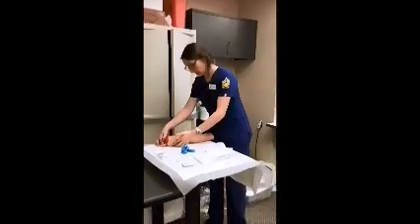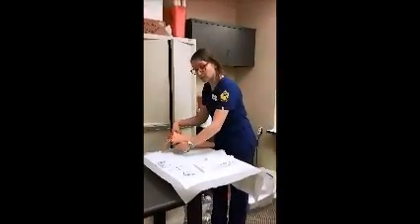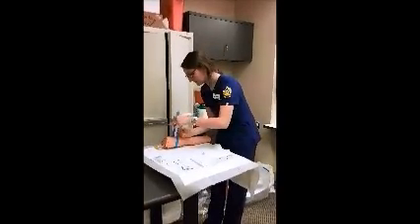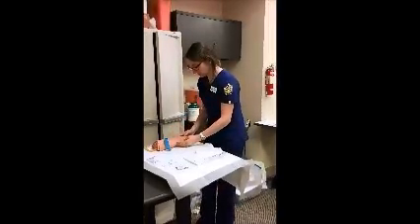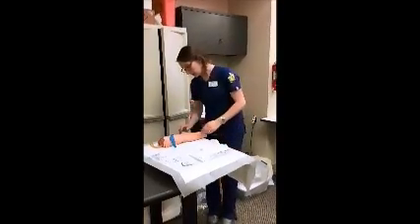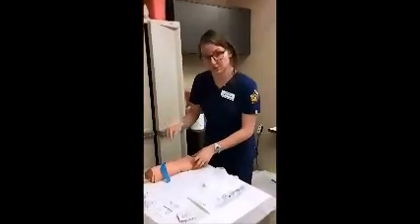I would start by assessing for an IV site, put on the tourniquet. Our Joe here has alopecia, so we're not going to need to shave him or anything. It should be about 4 to 6 inches above the injection site. Pop that tourniquet on. Make sure it's nice and tight, but also establish a radial pulse. Make sure it's not too tight. And I come up here and start palpating for a vein. You want to find a vein that's got some nice, good bounce back.